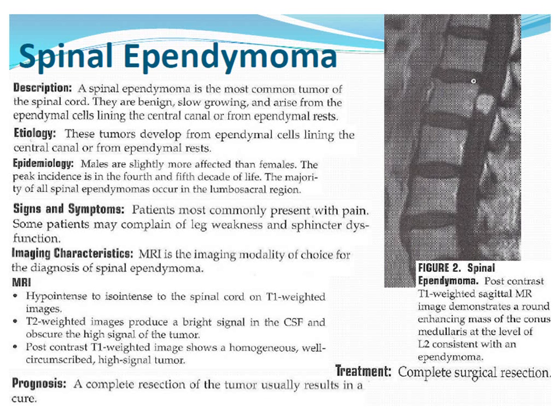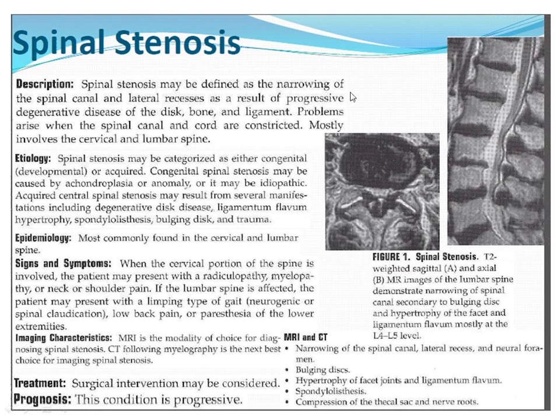Anytime you see these rounded lesions, that kind of thing, you want to give contrast to try to get a full evaluation. And they may not always be expecting that we need contrast. So just check with the radiologist if that comes up.